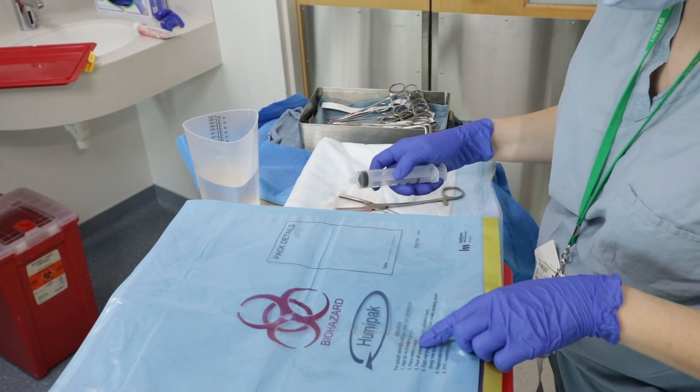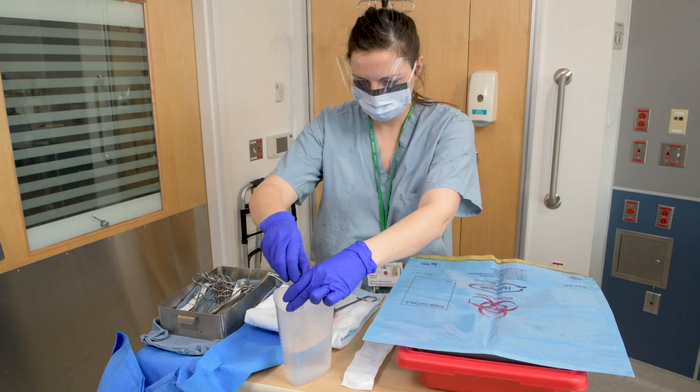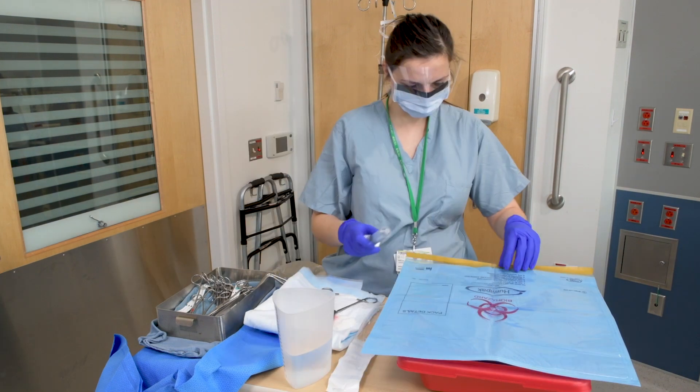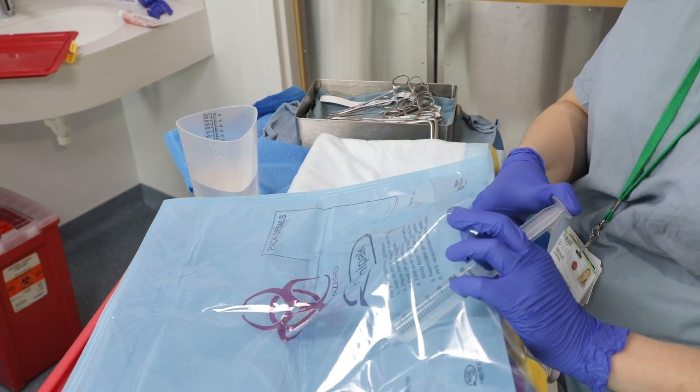Activate the HumiPak according to the instructions listed on the HumiPak. Measure the water level needed. There are many ways to instill water into the HumiPak system. Refer to your department for instructions.